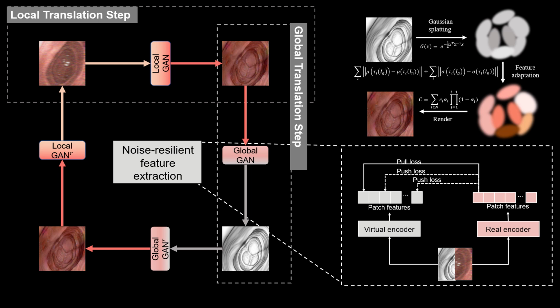Additionally, a noise-resilient feature extraction strategy is proposed. We introduce a novel contrastive learning strategy that leverages the inherent noise-resilient features from the virtual domain as a reference to guide the extraction of features from noisy images.